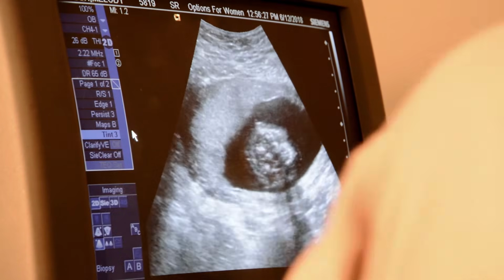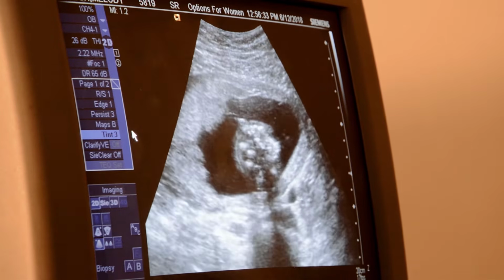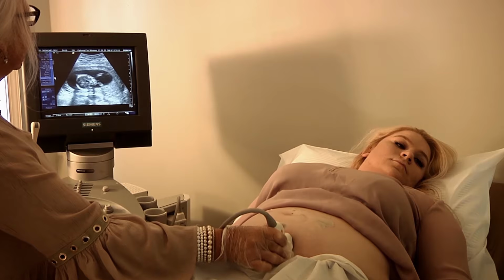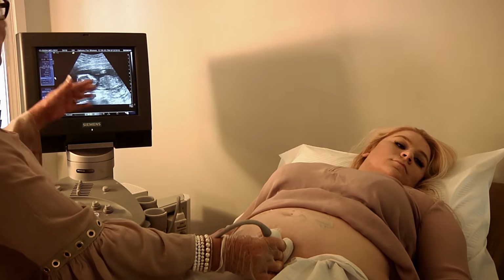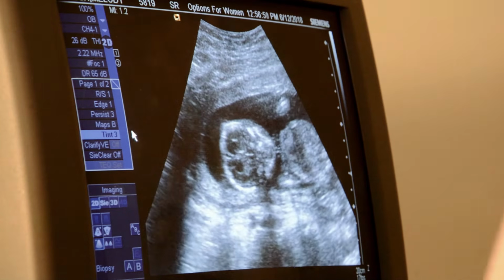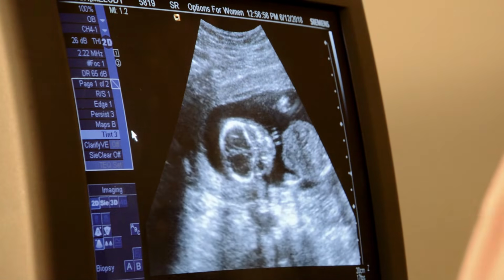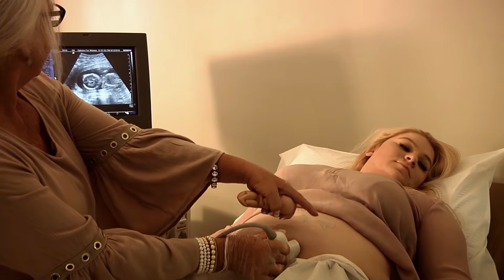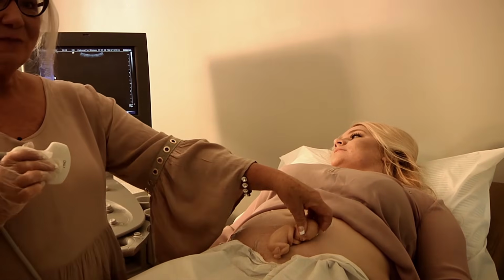Okay, now we're going to find the lie of the baby. Put any part of baby on the screen, any part. And then just stay where you're at and rotate until you stretch the baby out. Very slow. Keep rotating. You'll eventually stretch that baby out. And that's the baby, how he's lying, looking at your transducer, okay? So you take your baby model. And how is this baby lying looking at this? Can you guys, got any ideas? Look at the transducer. So the head's over here, right? And extremities over here. So this is how he's laying in mom's tummy, okay?